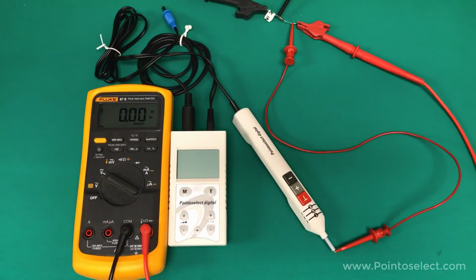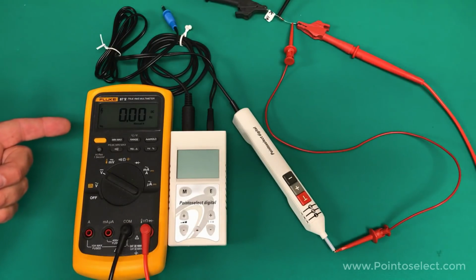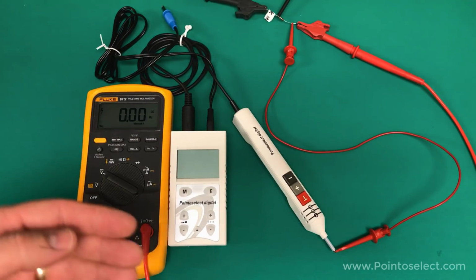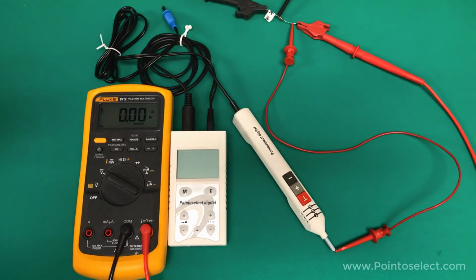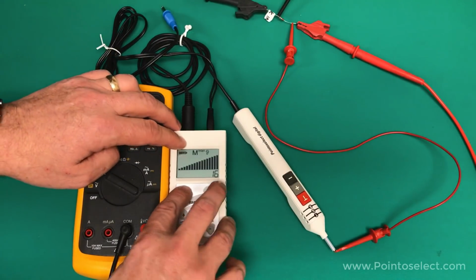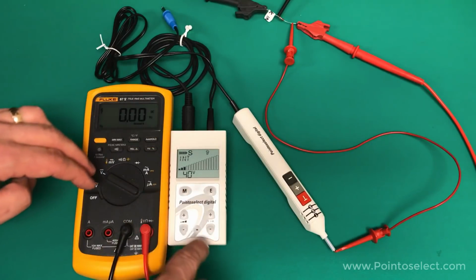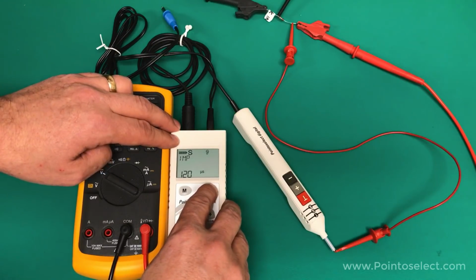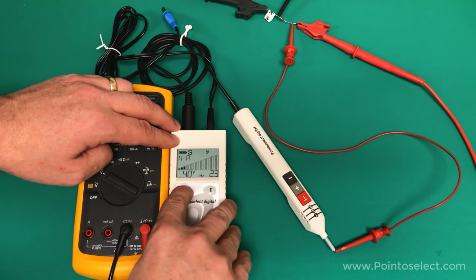Okay, I am back from Germany, back home in my own lab, and I'm super excited to test out my new Pointoselect digital. I've got my Fluke 87V multimeter here. I've got it set in frequency mode, and I'm going to test the frequency output to see how accurate it is and if it's providing the actual frequency that it says it's providing on the screen when we're doing the Nogier frequencies like you would use in auriculotherapy. So I'm going to turn the unit on here and walk through the settings. I've got it set for 40 volt stimulation intensity, 2.3 hertz for the frequency, and the impulse width is 120 microseconds.